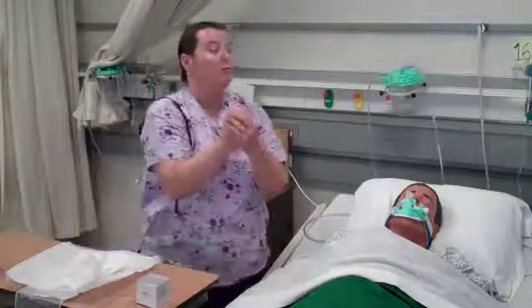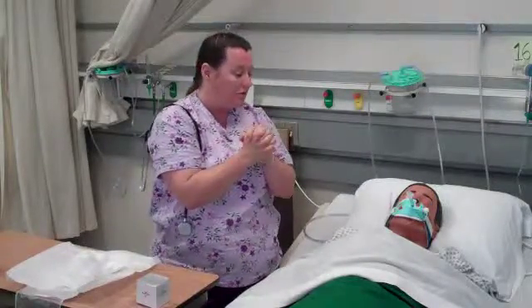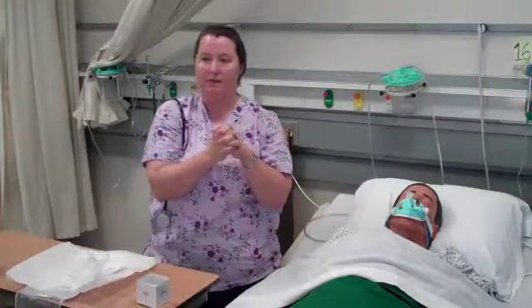After I wash my hands, I want to reassess my patient again. I will auscultate for his lung sounds, I will see what his vital signs are, and then I will of course document my findings and what I have done.